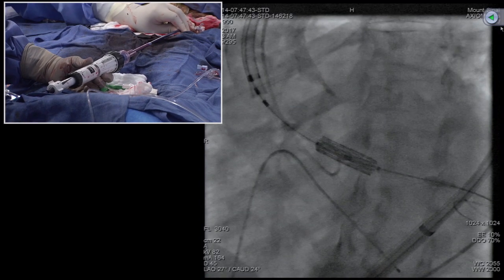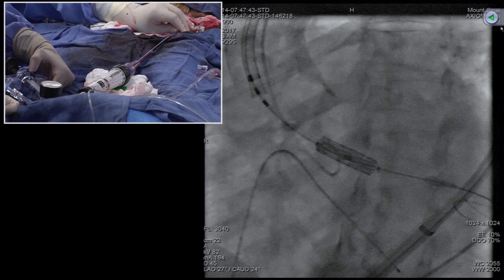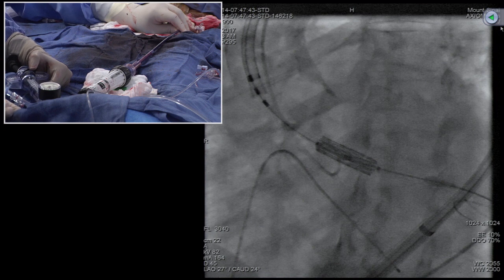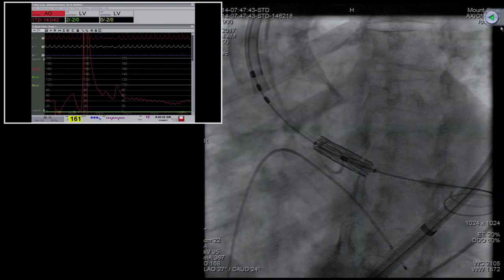Our goal should be 60-40, or do you want 70-30? No, 60-40. I think 60-40 is reasonable here. 60 into the aorta, 40 in the LV. Okay, ready? We have to pace 180. Who was the pacer? When you pace, you always make sure your blood pressure goes down to 40. Inject. The balloon is up. Okay, stop pacing. It's got to go in a bit.